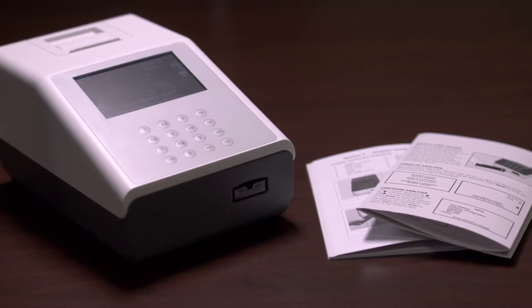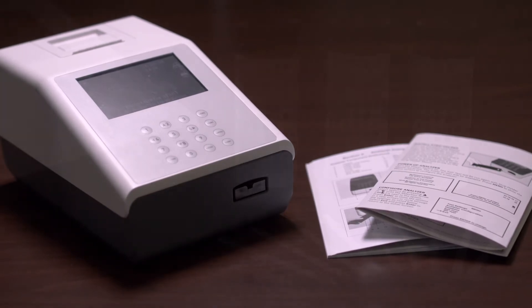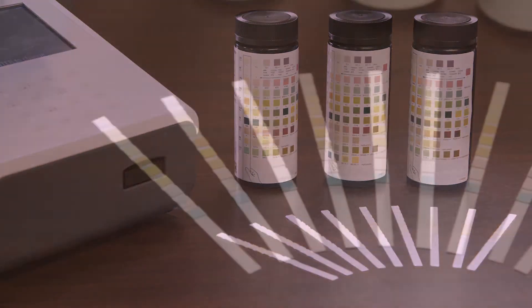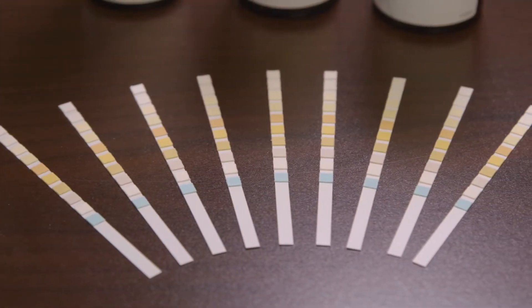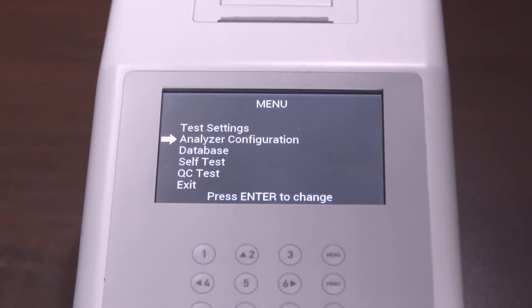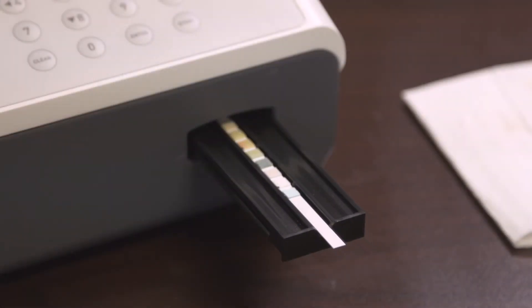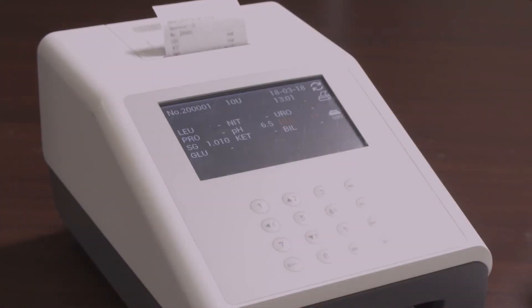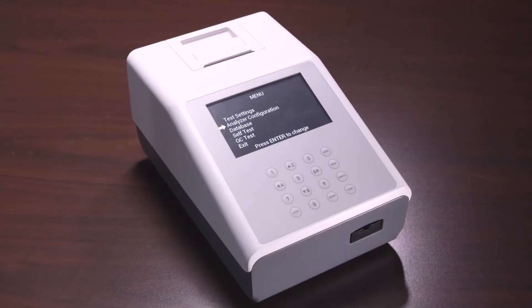The 120 urine analyzer is a manual reflectance photometer that analyzes the intensity and color of light reflected from the reagent areas of a urinalysis test strip. It is specifically designed for improved accuracy and efficiency, and it can read up to 120 strips per hour. In this video we will review the most commonly used features of the 120 urine analyzer.